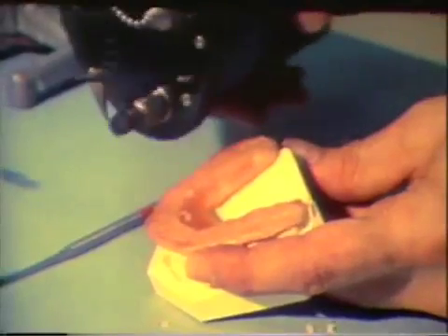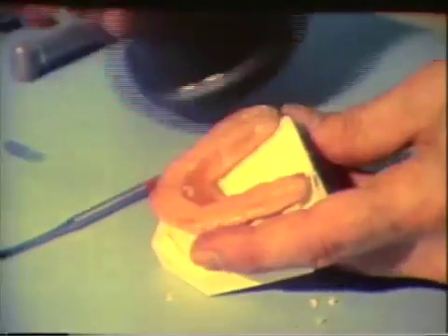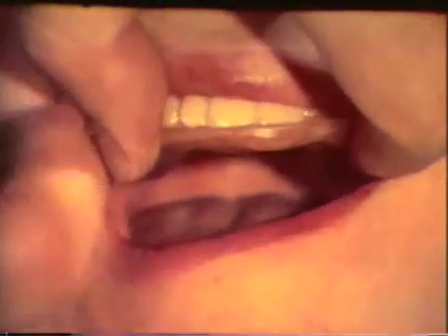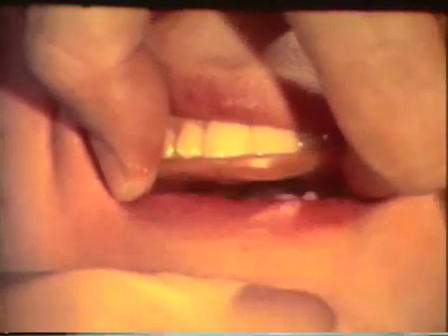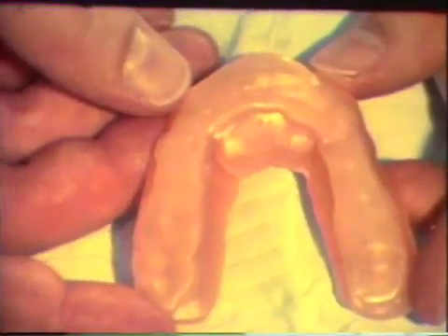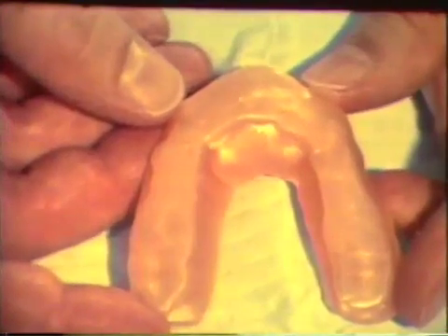An alcohol torch is used to soften the wax. The entire occlusal surface of the bite plane is softened in this manner. The bite plane model is tried in the mouth and the jaws are tapped together in centric relation. At this time, only slight imprints corresponding to all mandibular teeth are visible in the wax. The occlusal surface of the bite plane model is flat.